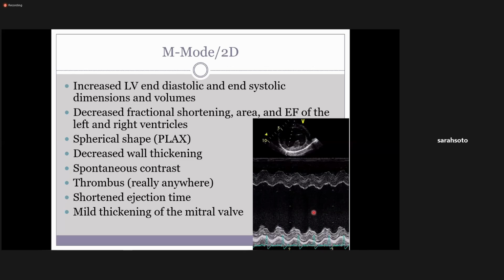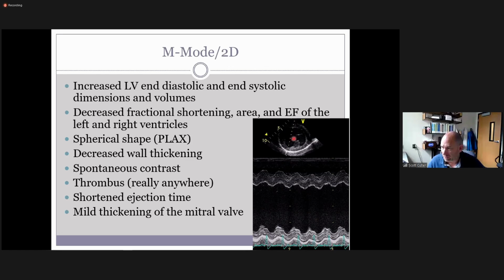I would say no, because you can only see one papillary. Well, yeah, and I think the other one's over here. You can sort of see it, but what I'm suggesting here is that it's not exactly in the center. If I was to draw a line, obviously this back wall is where they want to be, which is good, but I don't want to be here. I'd actually want to be over here, so it goes completely across that chamber, equally. So it could be slightly smaller being here than it would be if that line came from over here and through that same area. Normally I'd want to come back through this area, but then you're right in the papillary muscle and you can't tell for sure.